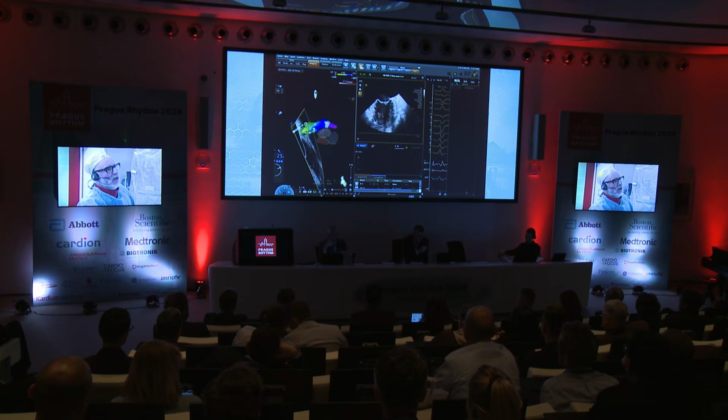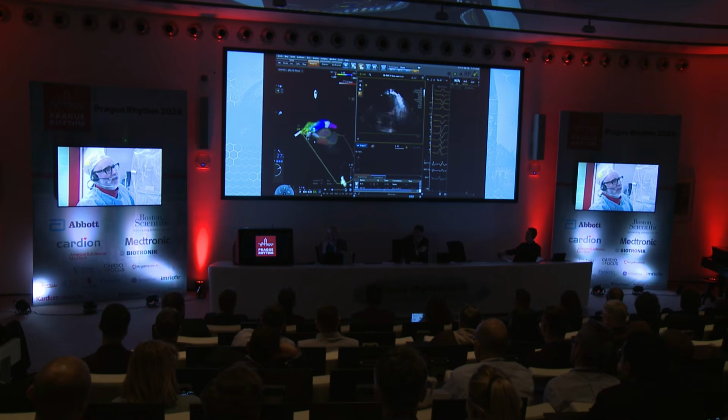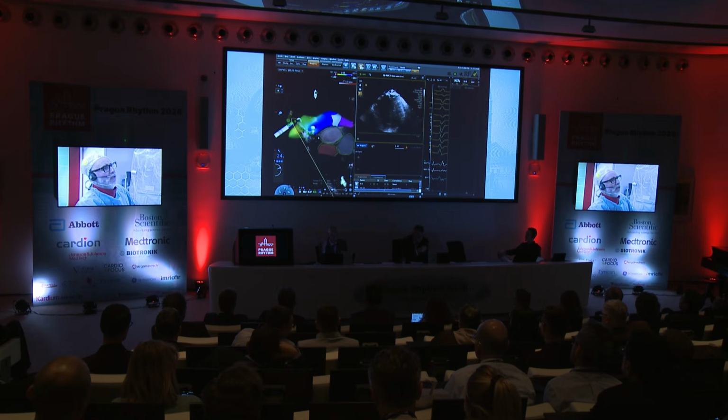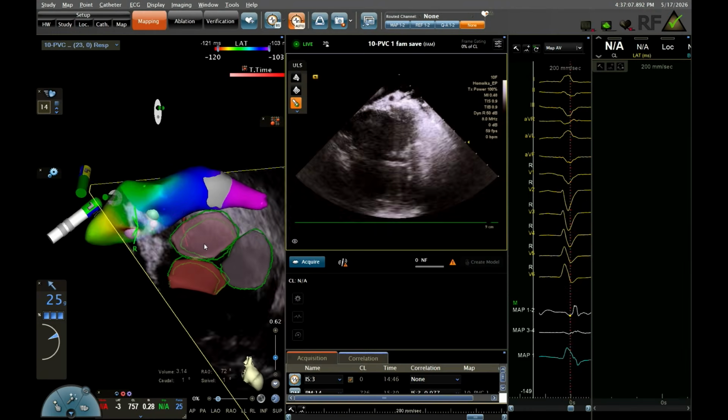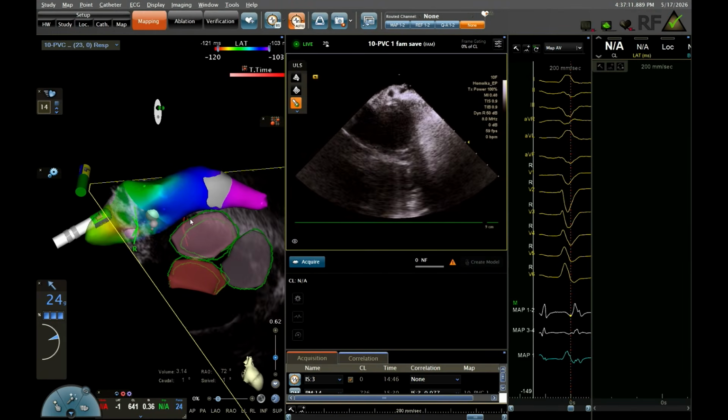Was that with RF or PFA? We haven't done anything yet. No, not today. The last procedure the patient received. No, nothing in the great cardiac vein. Then it was just Affera, and we tried from the endo, from the LVOT, navigated by the distance from the CS catheter as well.